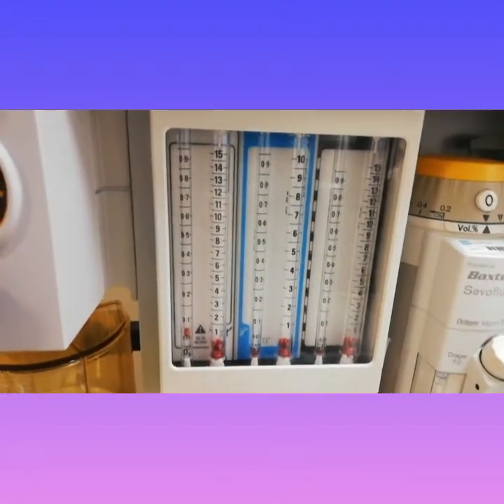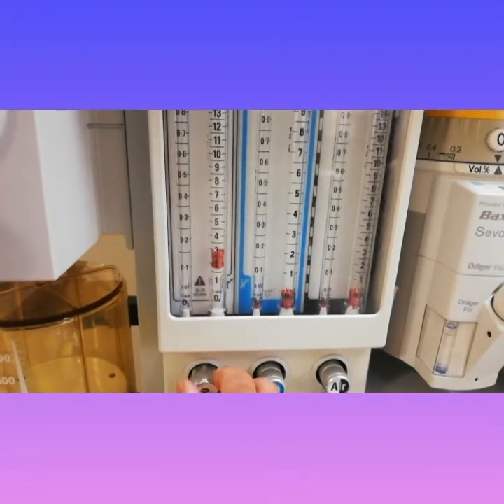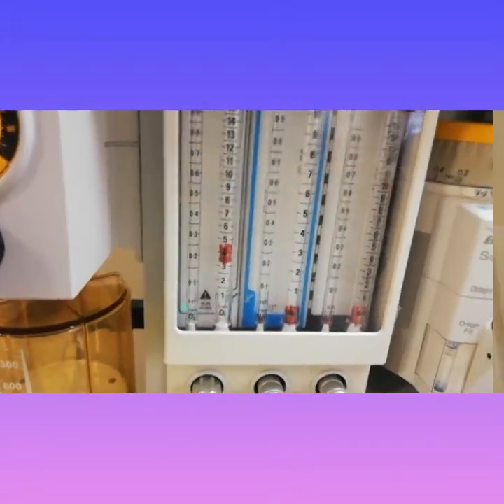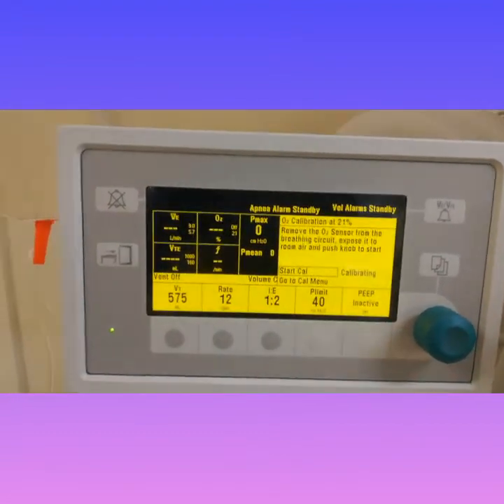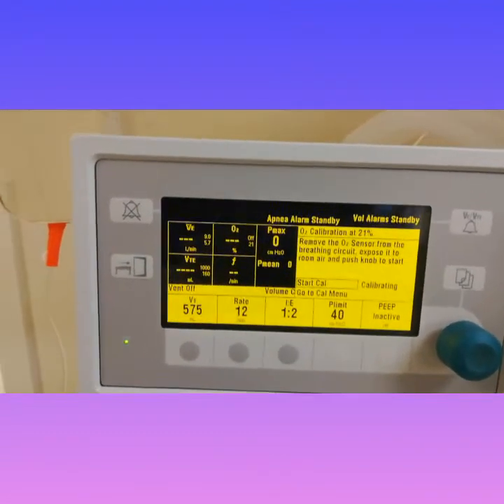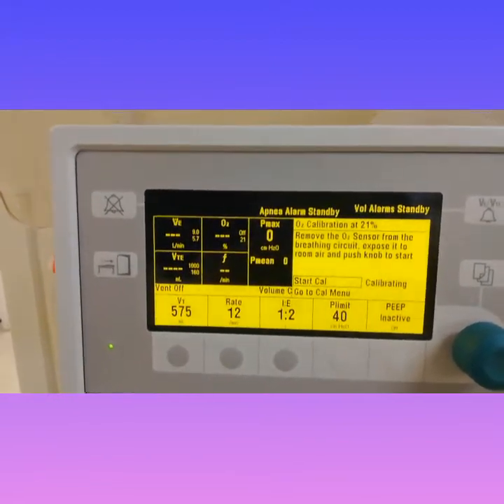Then turn the oxygen on up to four liters, then start calibration — it takes up to four minutes or so.